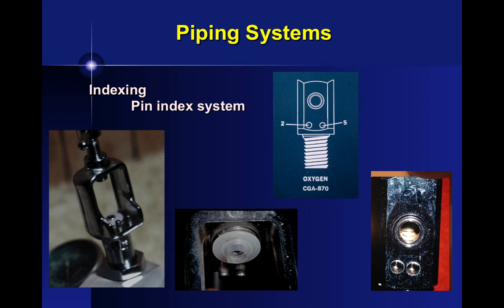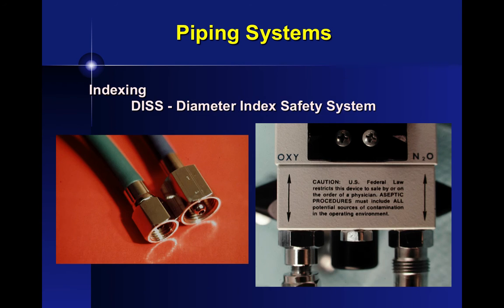In one of the future programs I'm going to present, it's going to be about the problems with nitrous oxide. And we did some research to show that diffusion hypoxia, which we all learned about in school, which was why we oxygenated people, doesn't exist with what we're doing with nitrous oxide. So it's completely safe to take the mask off. And had the oral surgeon in Texas done that, the young man wouldn't have ended up with all the problems he had. So let's go on.